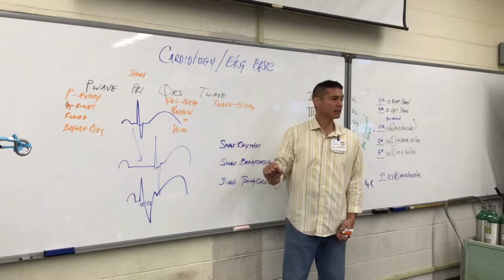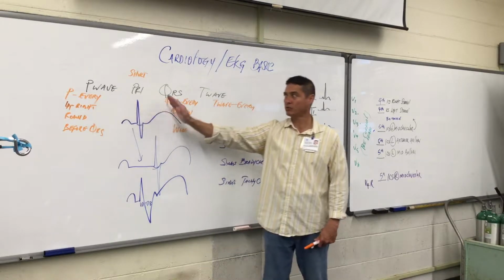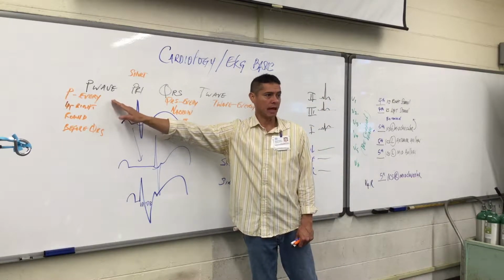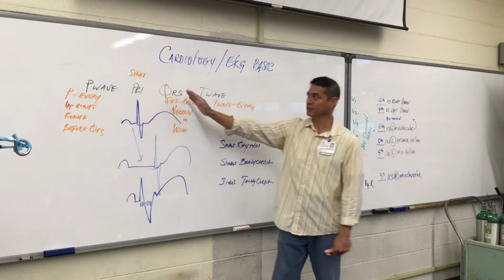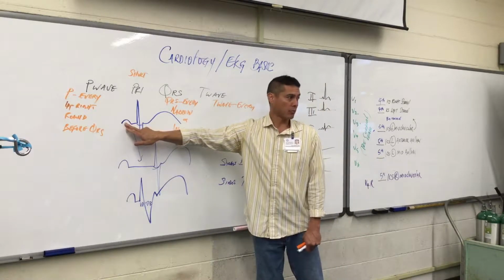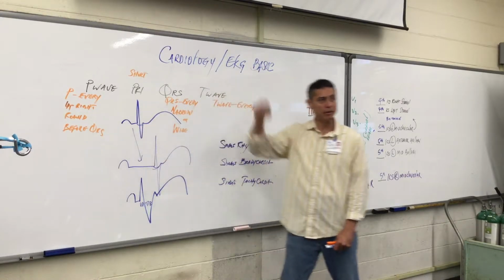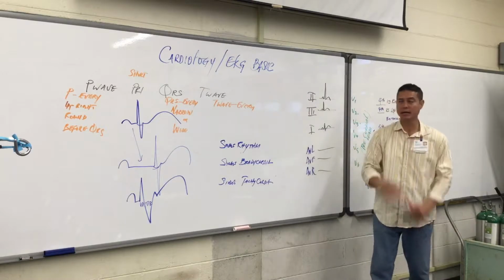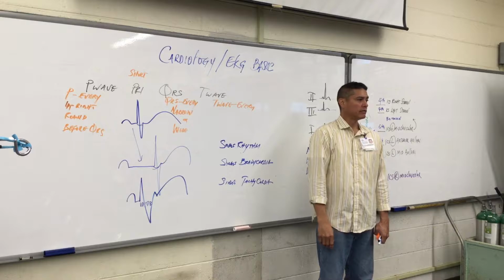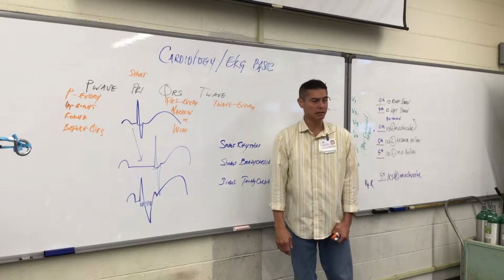Right? You start off looking at the rule. I need to check to see if I have P waves first. I don't go on to see, oh, do I have a PR interval or QRS? You need to find the P wave first. And you go to the next criteria, and the next criteria, and then finally the last criteria. For you visual learners, that first upright, round shape, you should have a slight pause in between, then the next up and down, squiggly, very narrow type of line, and then a large hump at the end is your T wave, representing your repolarization of the conduction system.